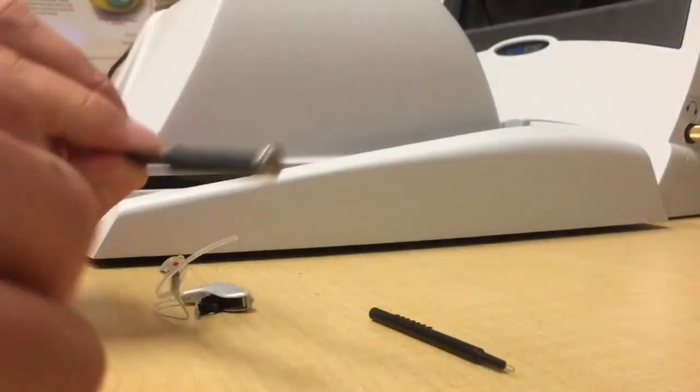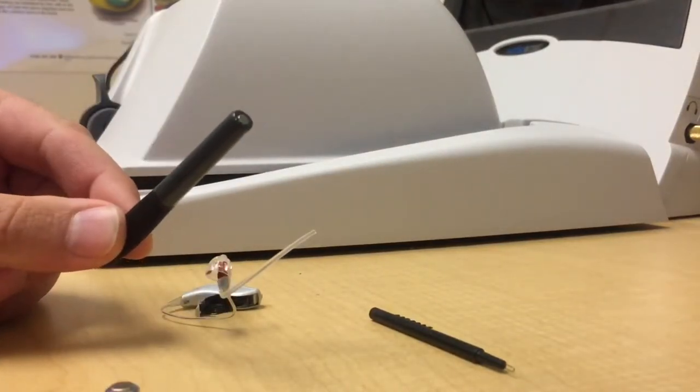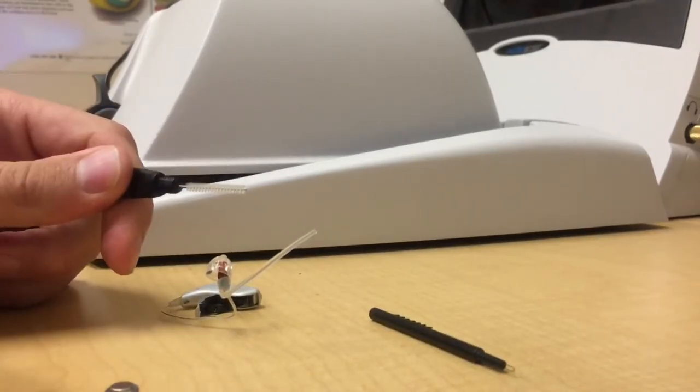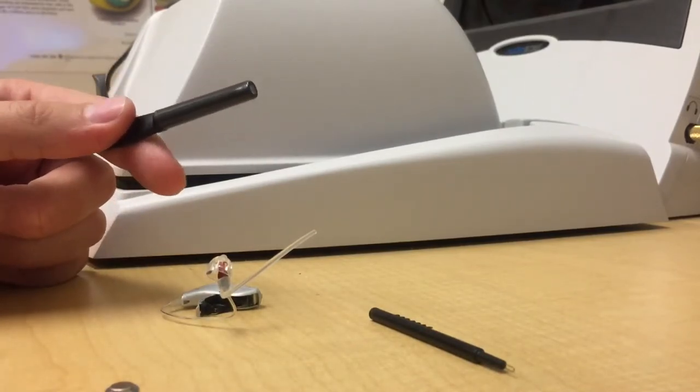So the stick I was using is just a cleaning tool with a magnet at the end. Oticon makes these, but they work with any hearing aids. There's also a cleaning brush inside of it that you can use. On Amazon, I think these are sold for about $10 each.